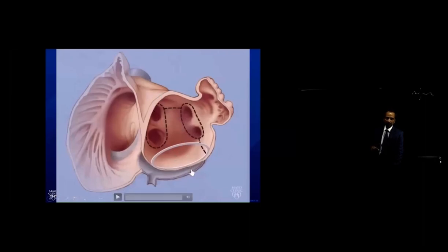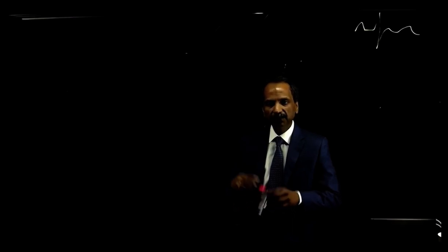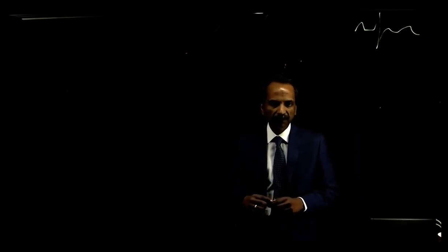Conversely, we may have a complete isolation of the vein, but entrain a flutter here and find either the sinus node artery or esophagus is nearby, making it difficult to complete. But part of the circuit is the mitral isthmus, and perhaps a line there will solve the problem, taking away the need to ablate near a difficult structure. So that's just setting the table for issues related to difficulties when we transfer our knowledge from cavo-tricuspid isthmus ablation over to the left atrium.